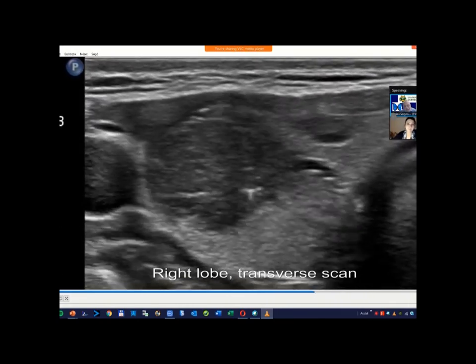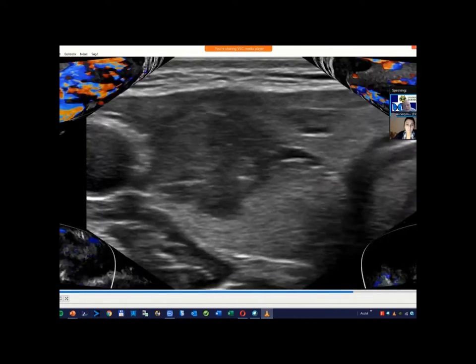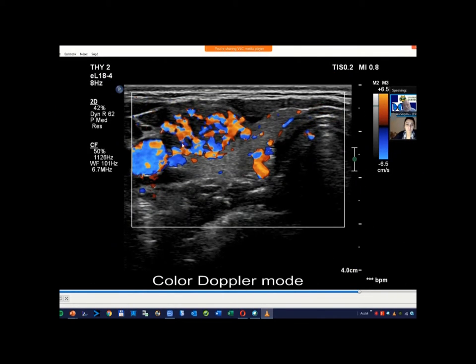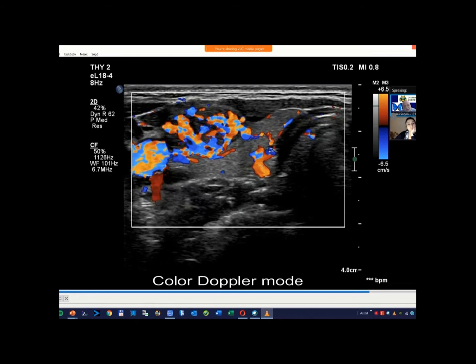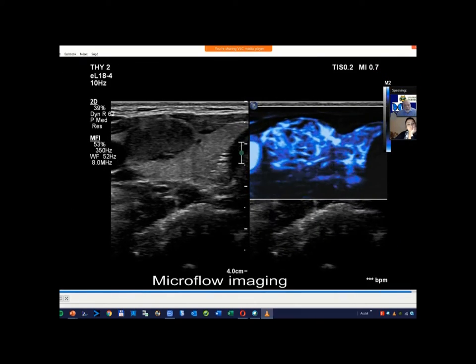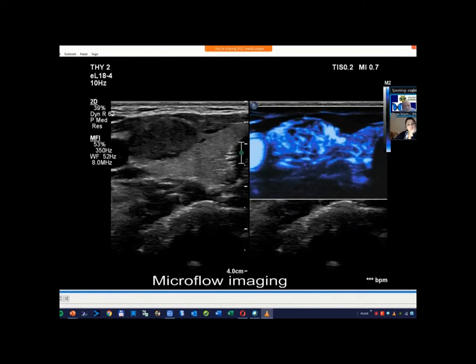There is another feature in this case which meets our current topic. This nodule has a chaotic type vascular pattern. As Andrea emphasized in one of the former cases, it is very difficult to gain adequate material from such a vascularized nodule. We have to make more attempts in such a vascular lesion, otherwise only blood will appear on the smear. This is the microflow imaging which depicts the vessels.